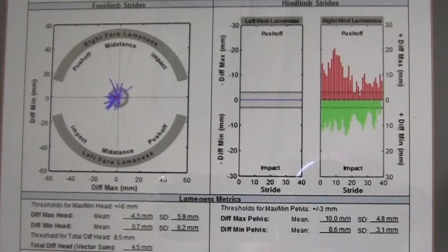On the right side of the screen, the left hind limb is on the left and the right hind limb is on the right. There is obviously a lot more going on in the right hind limb. For the hind limbs, anything over three represents lameness, and this horse has values of 10 and 8.6. Red lines indicate a push-off component to the lameness and green lines show an impact component, indicating an overall prominent right hind limb lameness.